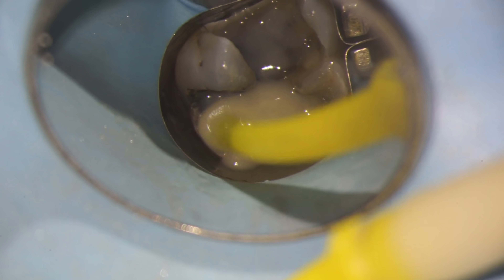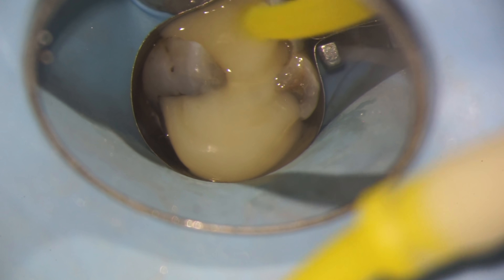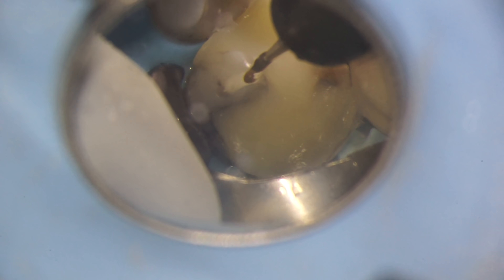Then I put the rest of the foundation in. This material sets in two different ways: as soon as I shine the light on it, it will achieve an initial set and initial hardness, but it also sets chemically as well, so after some time it'll harden even more. Then I put my rubber dam clamp back on and start the process for trimming the tooth for a crown.